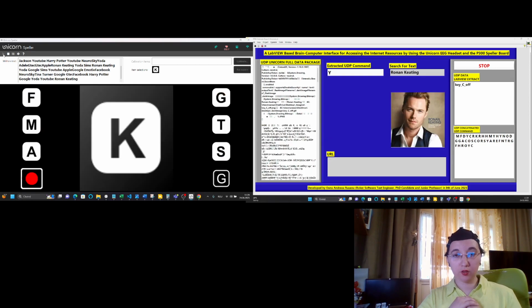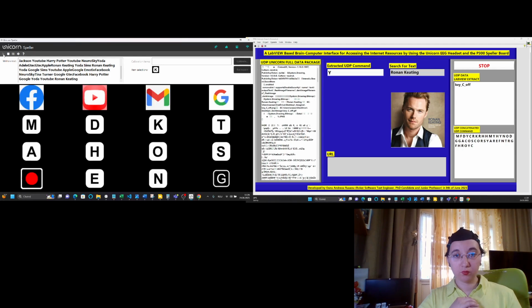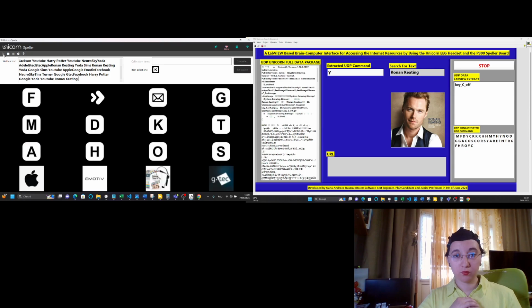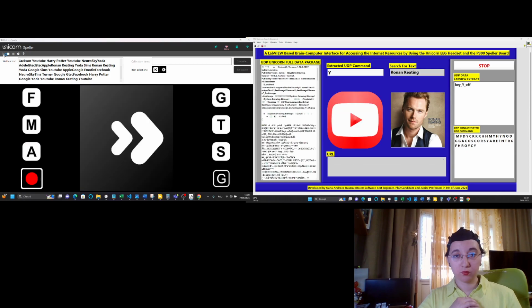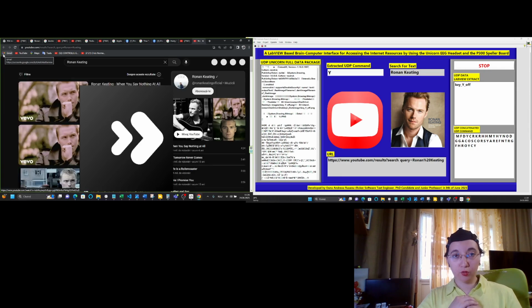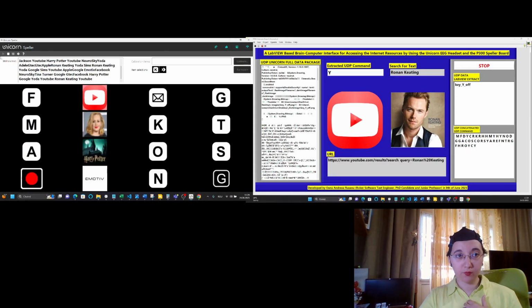Okay, Ronan Keating correctly selected, and now YouTube. YouTube correctly selected. Google is opening the YouTube web page, and now the search text is related to Ronan Keating and the content is displayed.